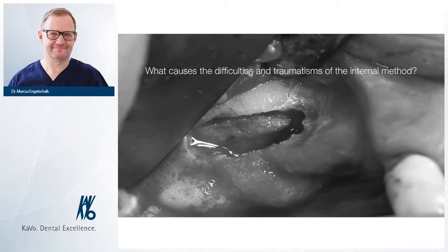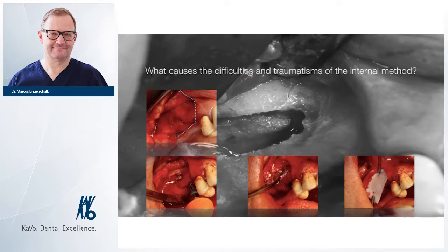So the classical sinus lift is not minimal invasive. In this case, it's a maximal invasive thing we can pick. Well, the osteotome technique or the sinus lift with the balloon is something in between, because you have to drill a hole, then you have to crack the residual bone, and then you bring in the balloon.